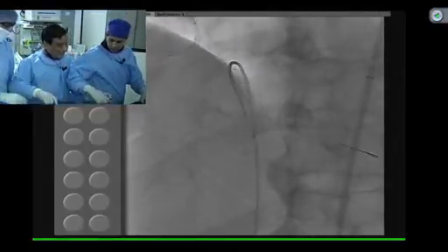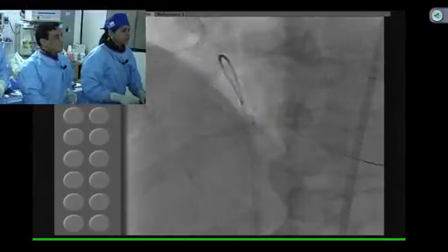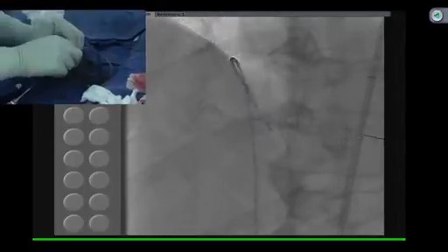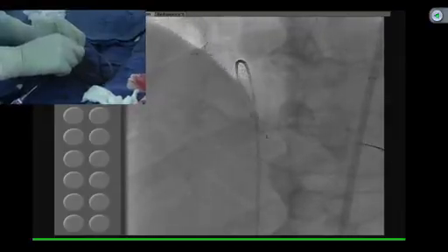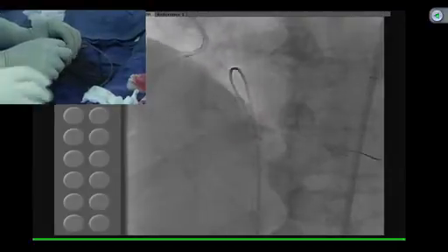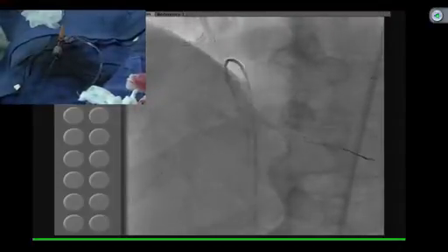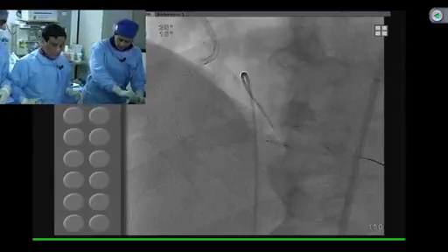Yeah. So this is a 2.75/23. 23, yeah, that's fine, because you don't want to put in too many layered stents there. That's exactly correct. Good. So what changed was the length and the size of the stent, and more important, if you see, I took the Fielder wire from the AV continuation and went to the PDA. So I went on the Fielder wire.